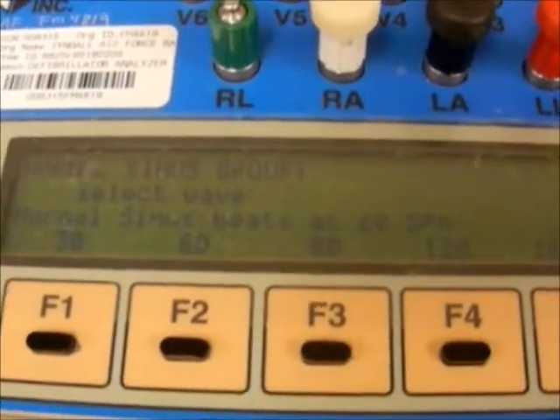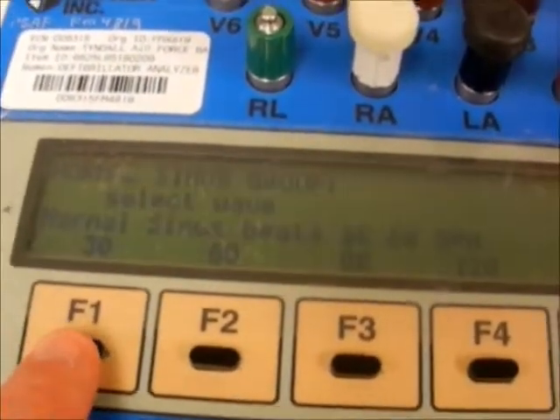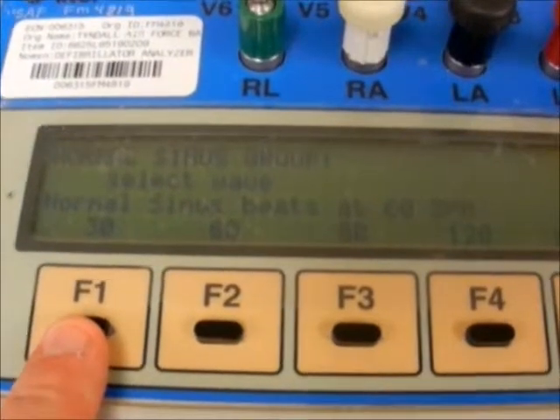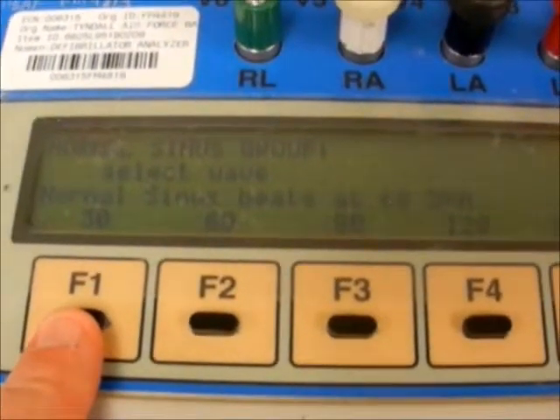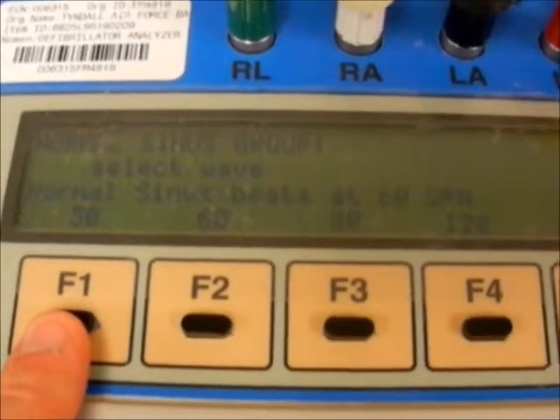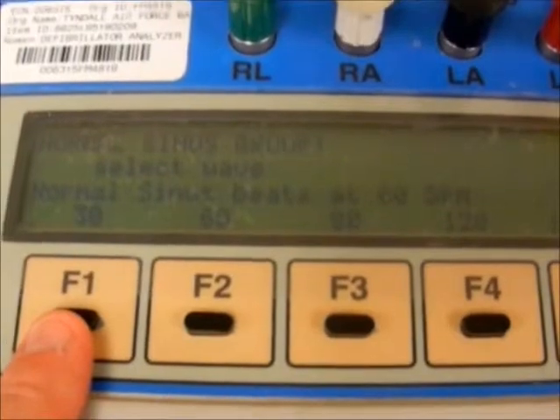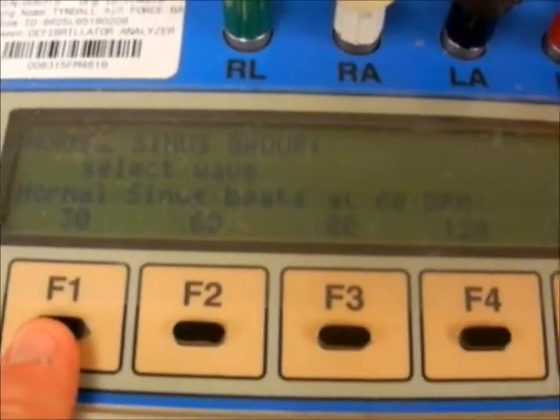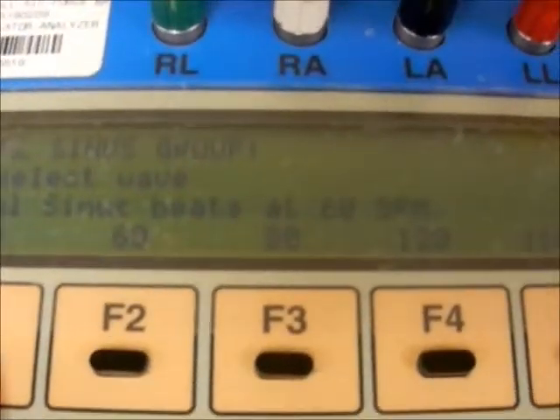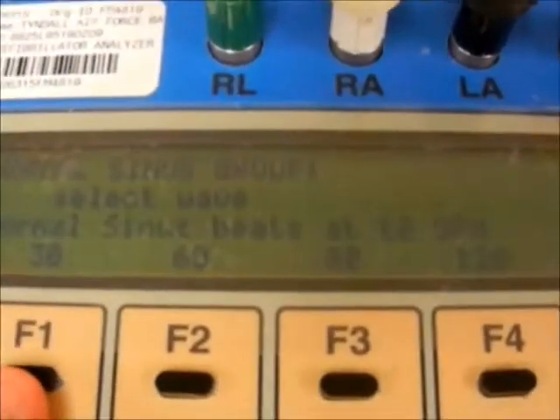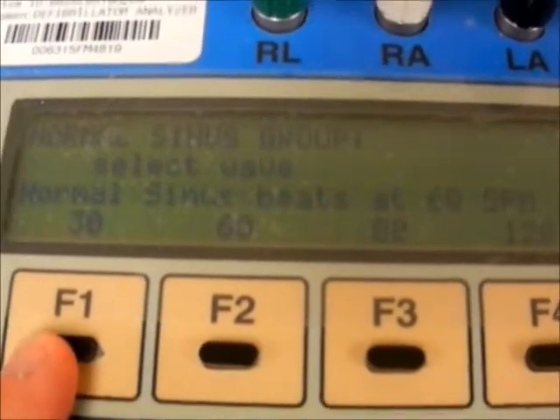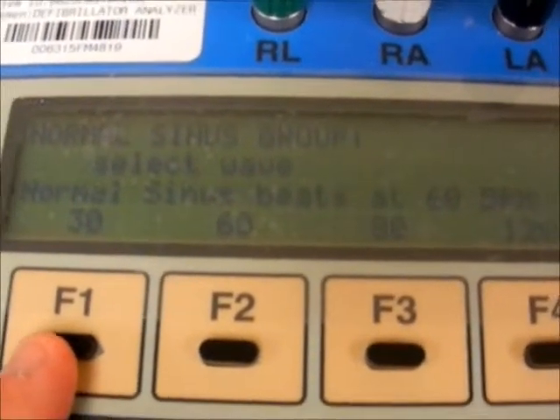Here on the defibrillator analyzer we will press F1, which will select 30 beats per minute, and drop that ECG signal below its limits to make the device alarm. Once it starts alarming, we measure using our stopwatch how long that takes.